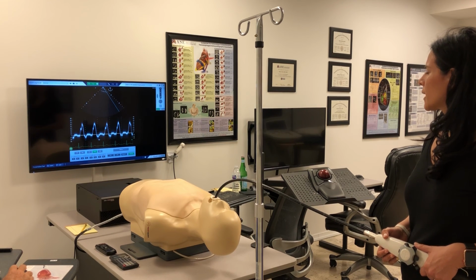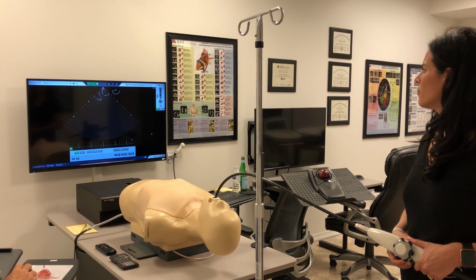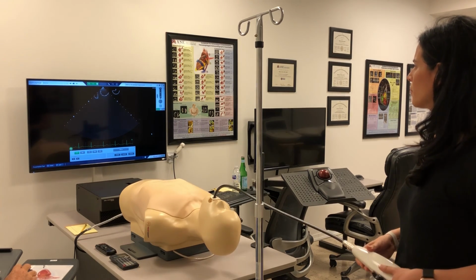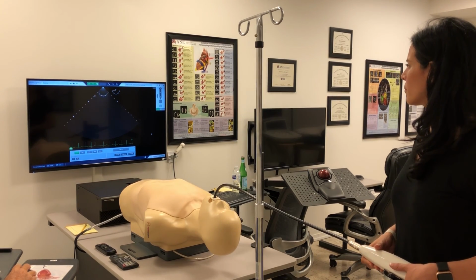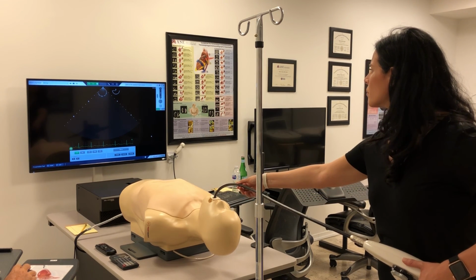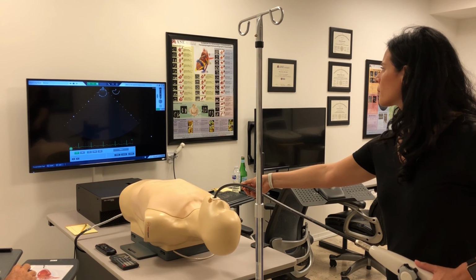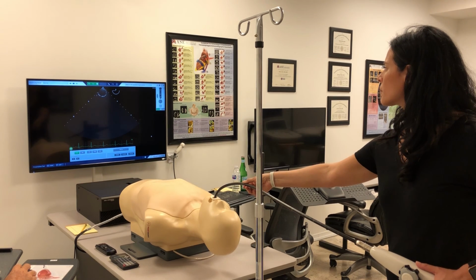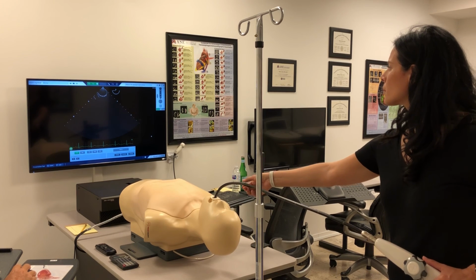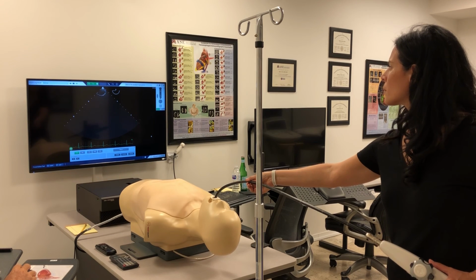Good. Now let's go back to short axis. I'll turn off the PW for you. And center the descending aorta in short axis, and then carefully withdraw the probe, inspecting the aorta as you go along. The aorta is going to want to try and get off screen because it changes its position relative to the esophagus. They call that the setting sun. And you keep pulling, and as soon as you feel the aorta start to blossom out into the arch, then the idea is to pull a little bit further, then stop.